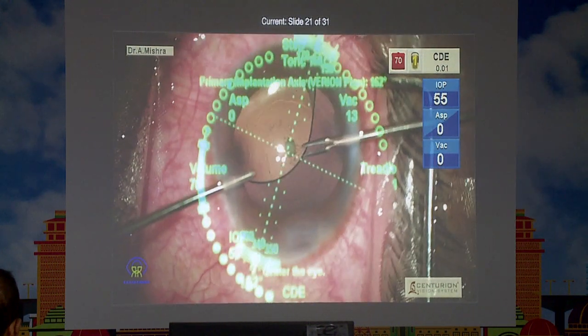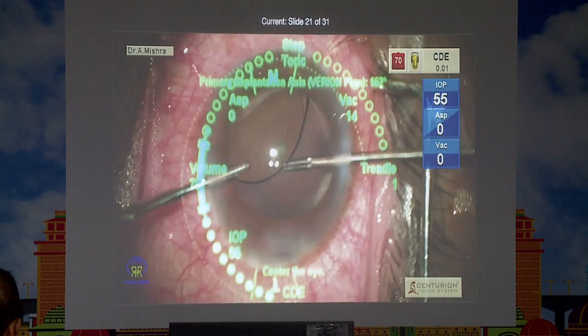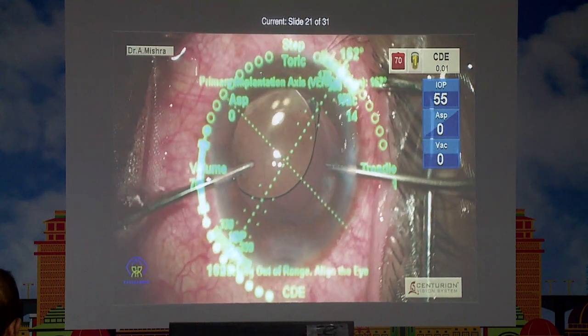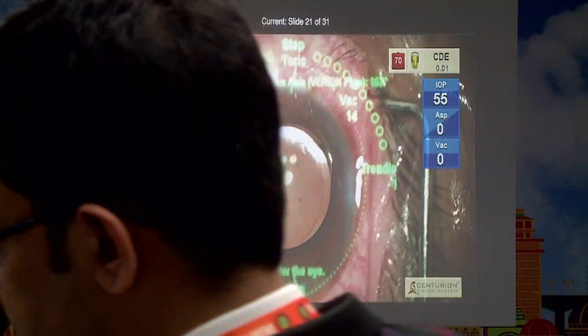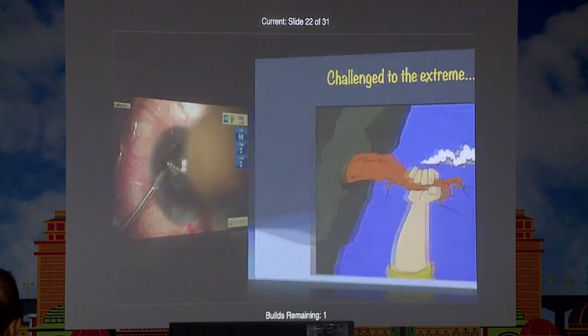So this is something, if you're not using viscoelastic and doing these steps under cover of BSS, then it is a little tricky. I completely understand that, but it's not undoable. It is pretty much doable. You just have to have that much control in the right hand. So now we can see that the plaque is removed.